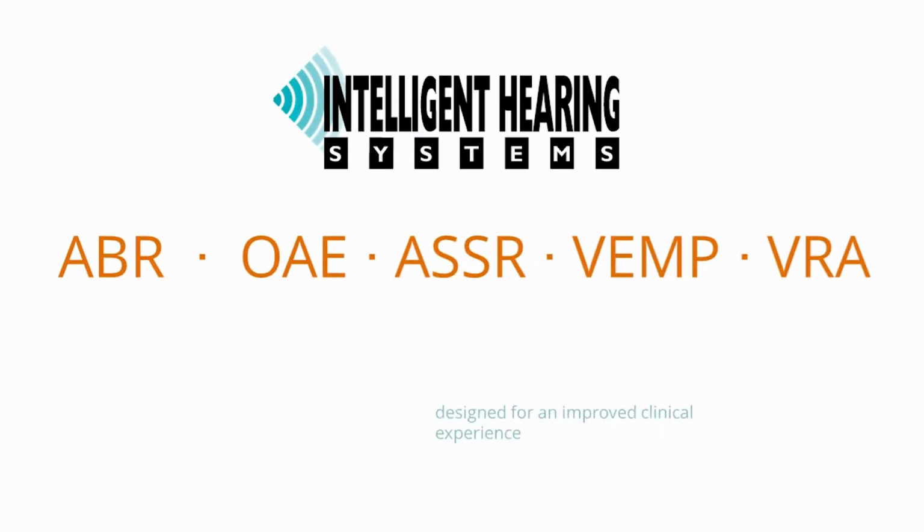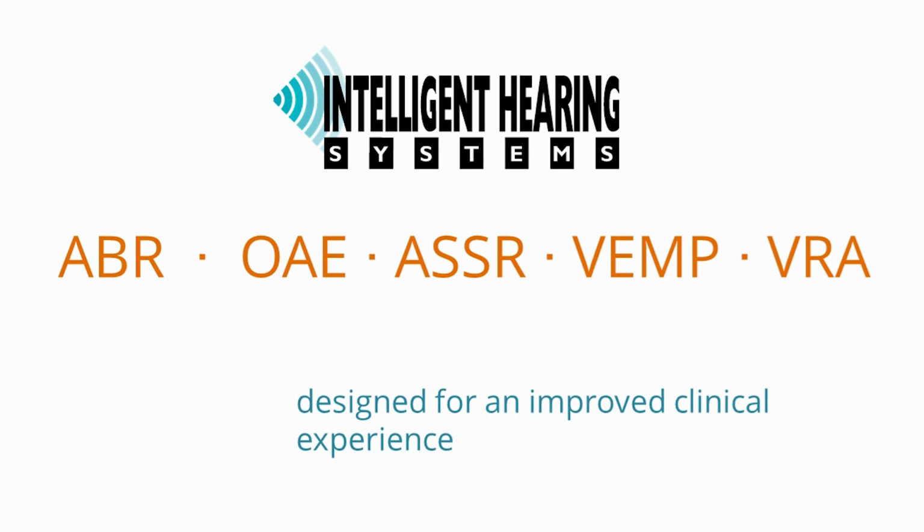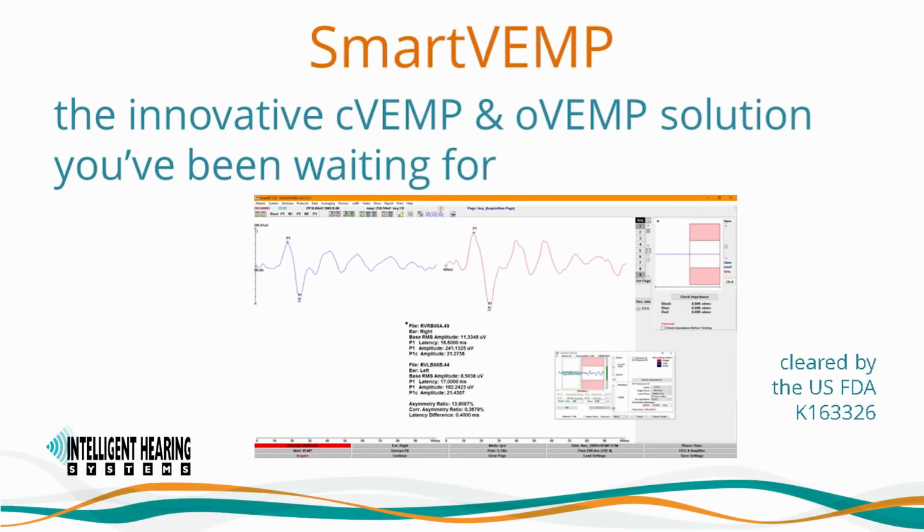The most advanced VEMP module in the market has been enhanced to become the ideal tool for vestibular evoked myogenic potentials. The SmartVEMP module is the only device cleared by the FDA for CVEMP and OVEMP testing on patients of all ages.